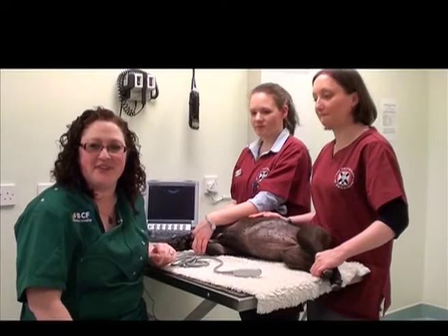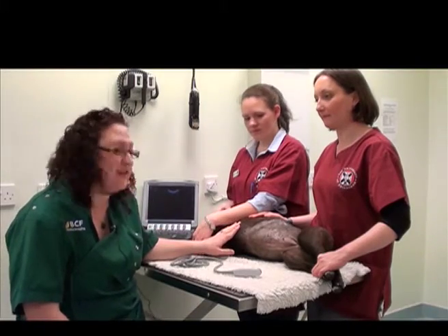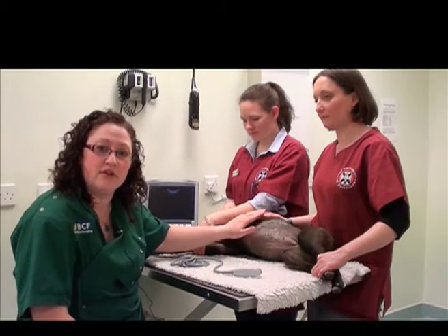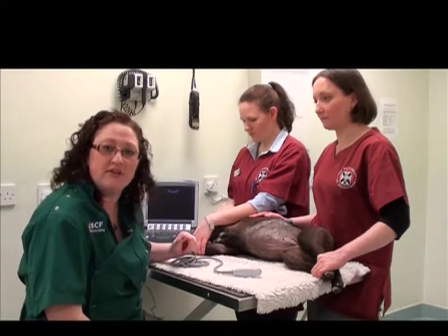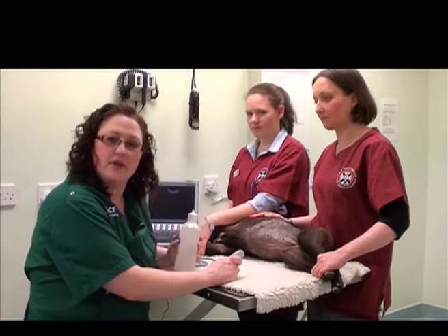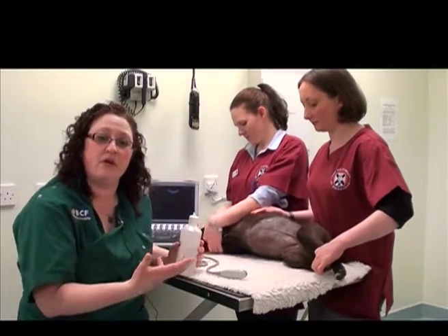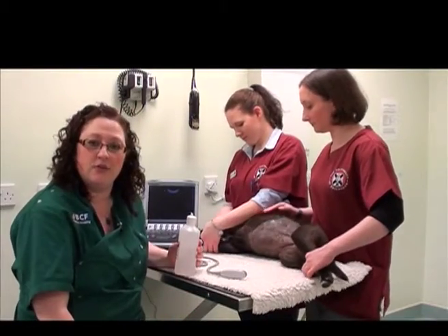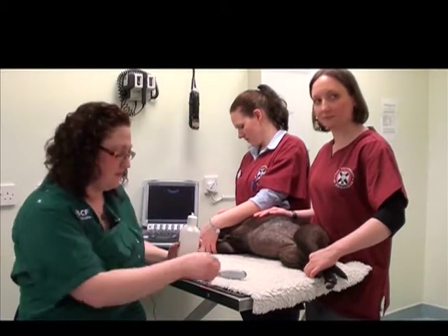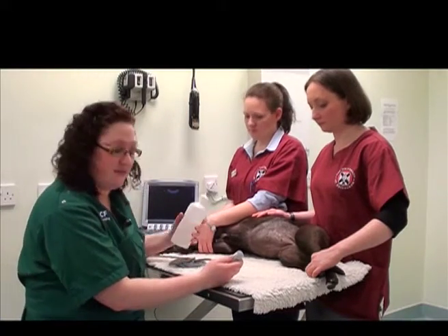Now we're ready to start our abdominal ultrasound examination. Our patient has been appropriately prepared, we have ultrasound gel already in contact for about five minutes, and our machine is set up. We'll apply a bit more ultrasound gel to the probe itself and get started.